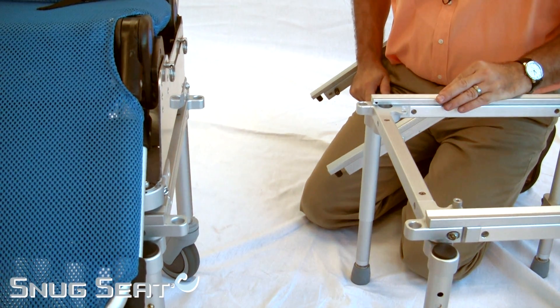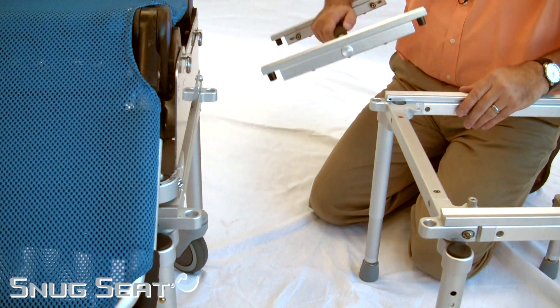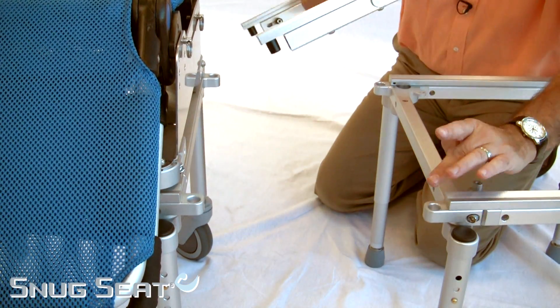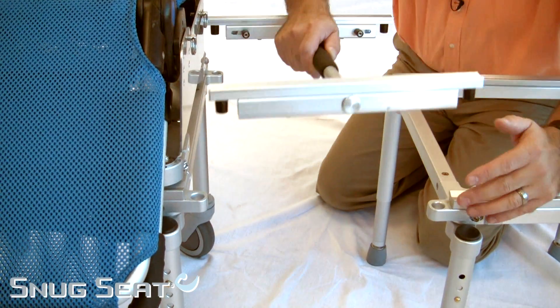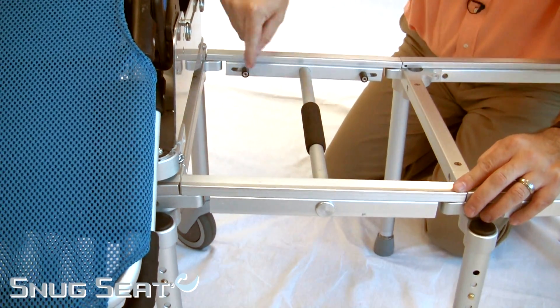To place the bridge, simply roll the rolling base next to the tub, drop the bridge into the locator holes, and lock in place.